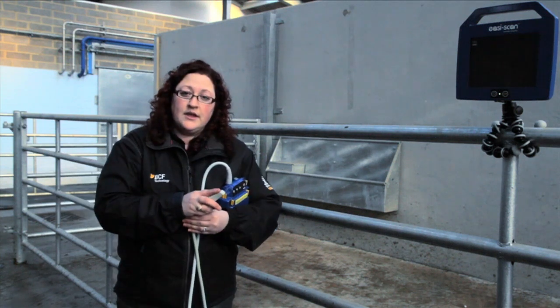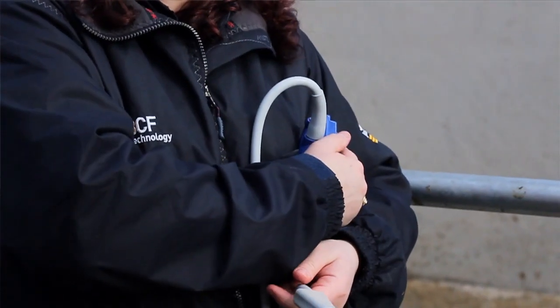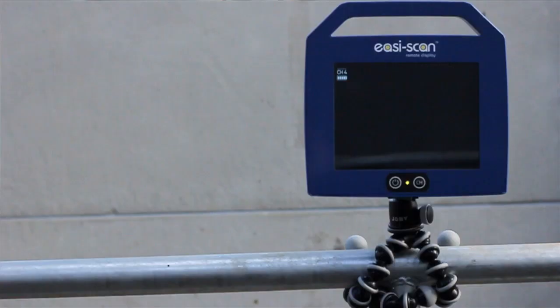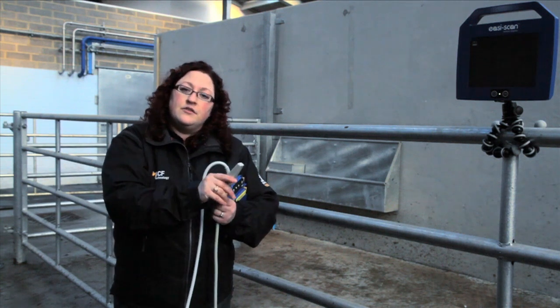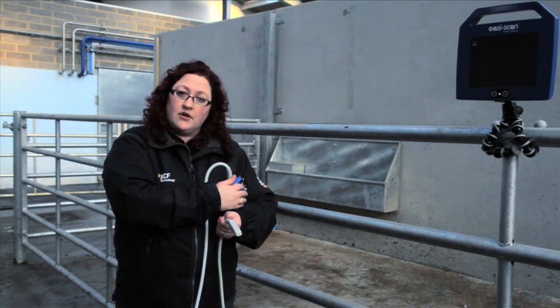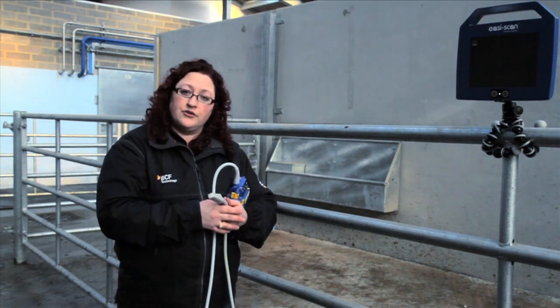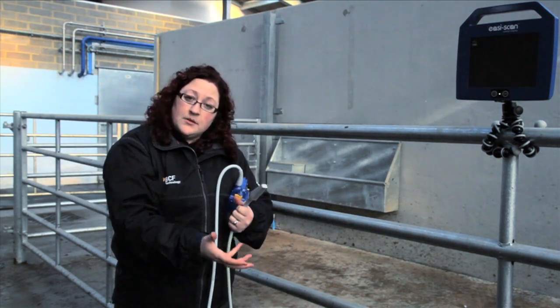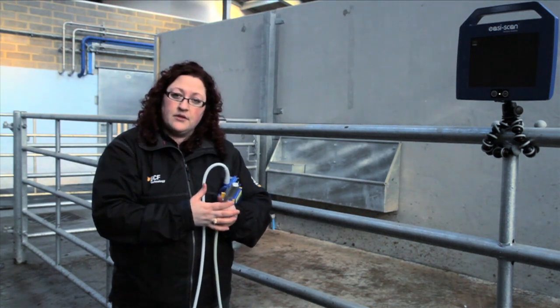So in summary, the ultrasound machine setup will include the console, the viewing device, and the probe. The controls that we can change on the console to improve the quality of the image, depending on whether we're looking at structures that are superficial or deep within the cow, include frequency, depth, and gain.